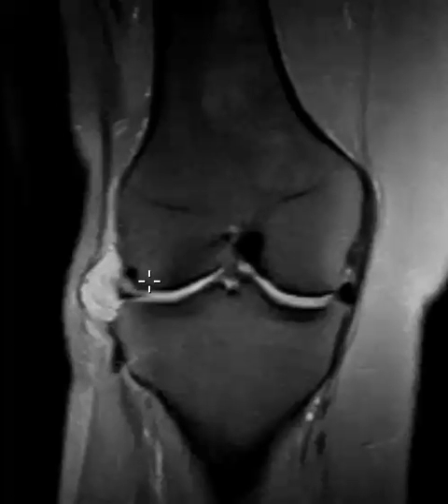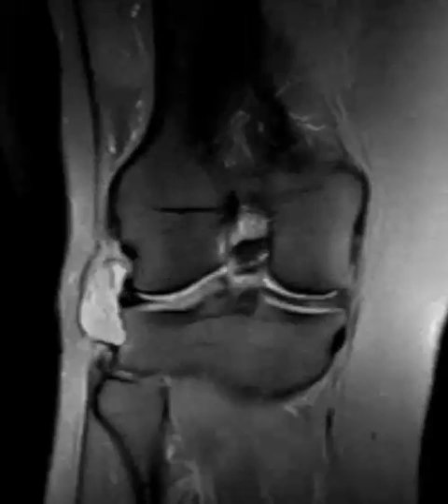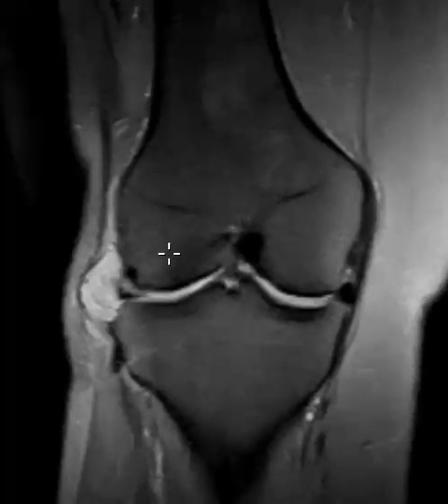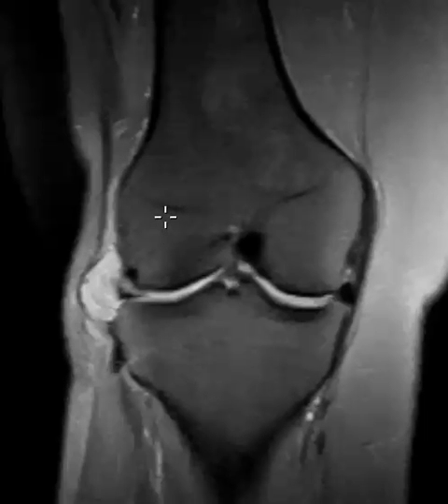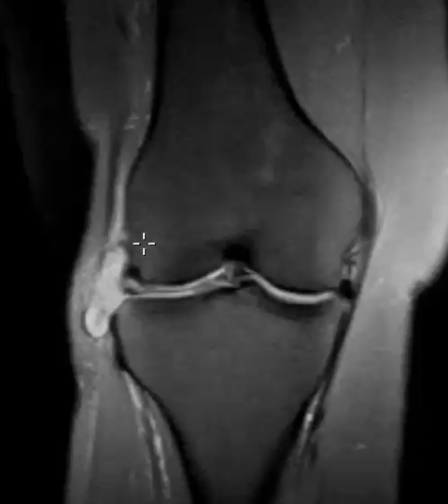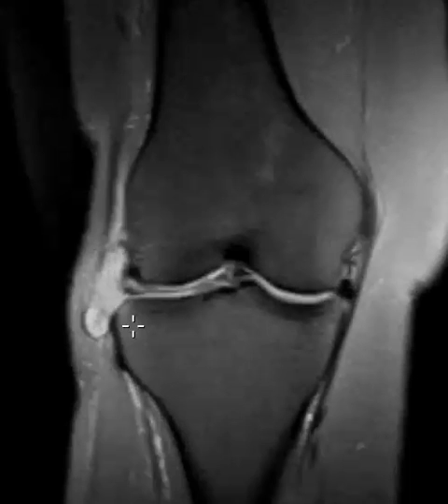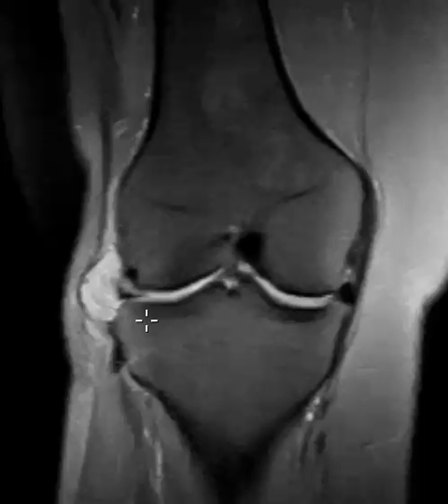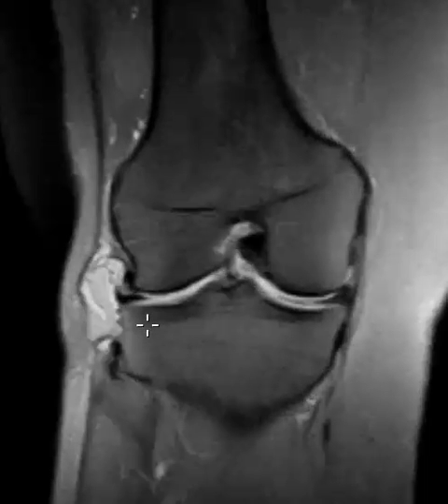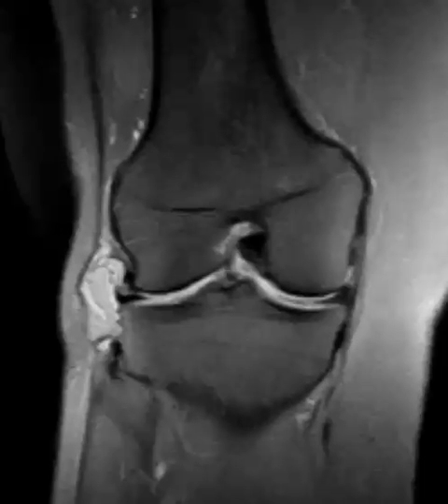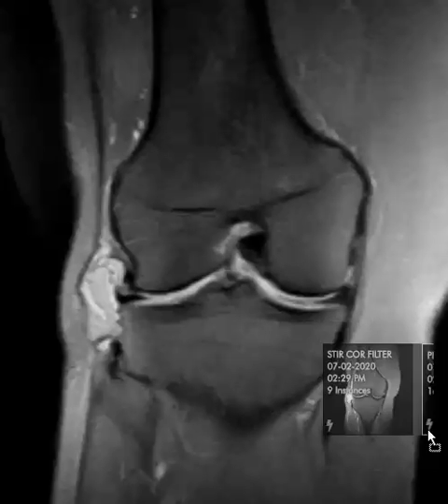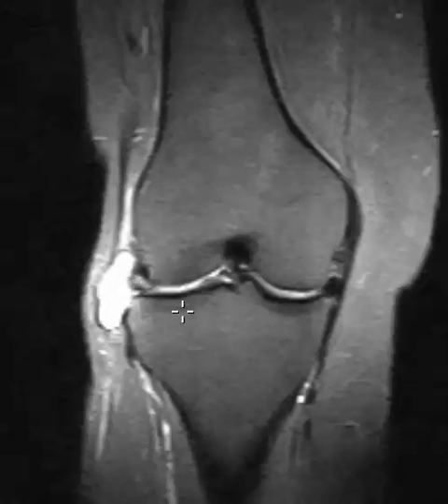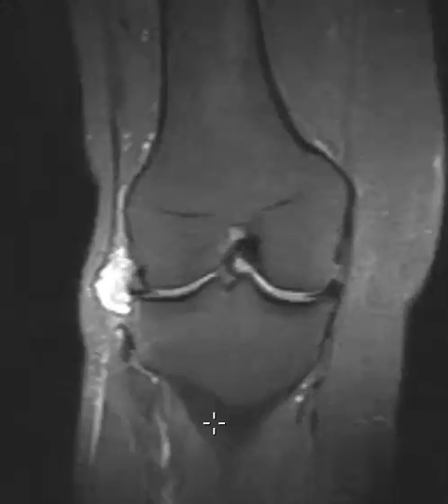So, what to call this? Many people will call this a meniscus tear, but that is technically not correct. A true meniscus tear contacts the superior or inferior articular surfaces. If surgeons perform a scope, they expect to see the tear on the top or bottom. This finding does not contact the superior or inferior articular surfaces — it only contacts the capsular surface — so it is not a true meniscus tear.